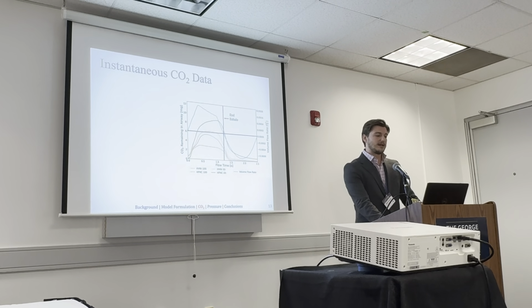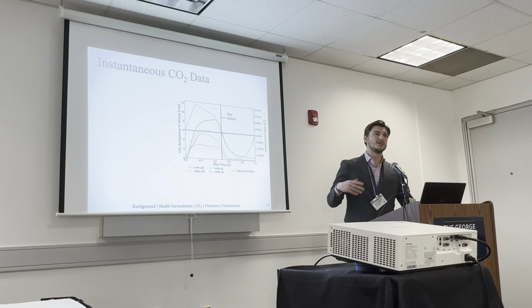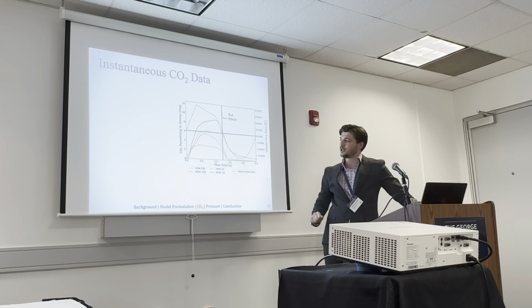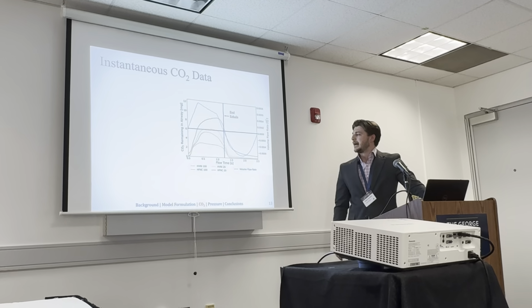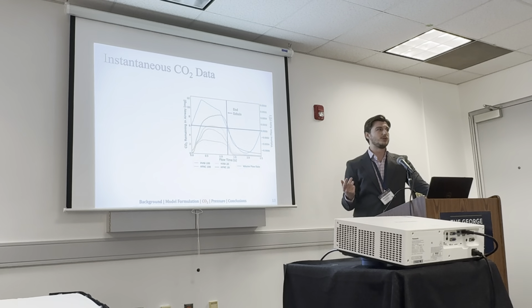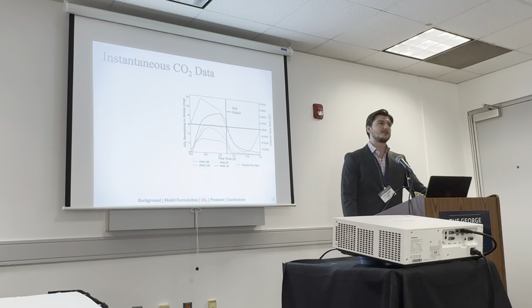Now if we look at this data plotted, on the left-hand axis you see CO2 remaining in the airway in milligrams. These four curves, HVNI 100, HFNC 100, HVNI 20, and HFNC 20, indicate the therapy type and then the mouth open percentage. And then in blue is the volume flow rate. That's just showing you what the patient breath cycle looks like, and that volume flow rate is on the right-hand y-axis.